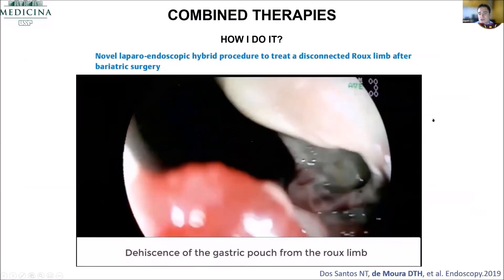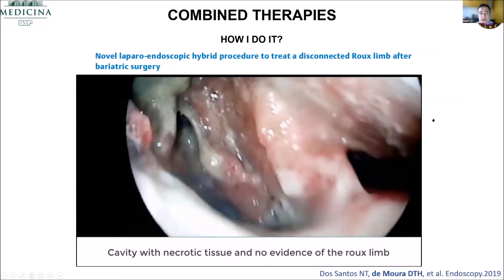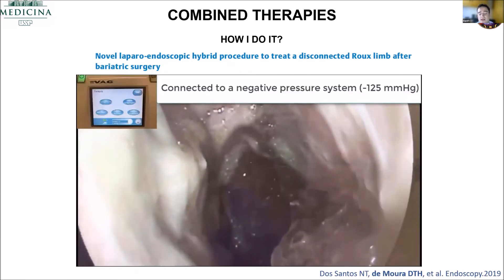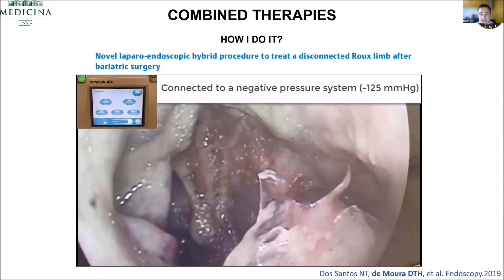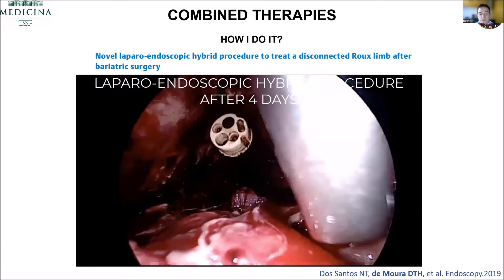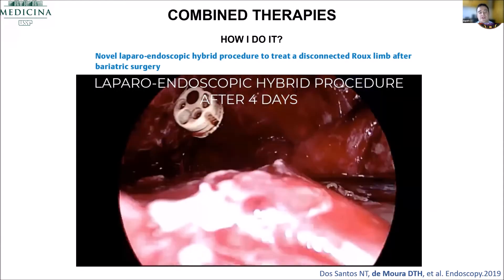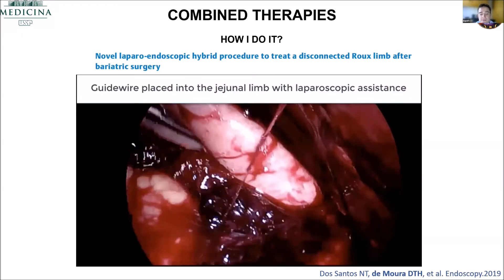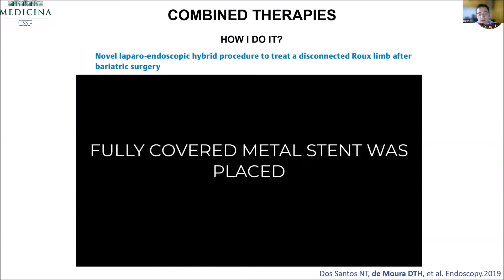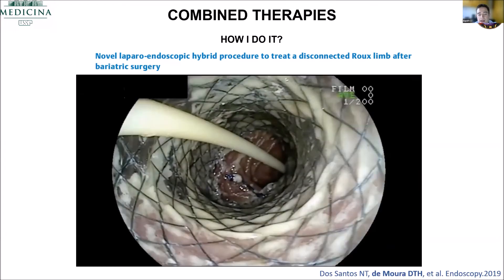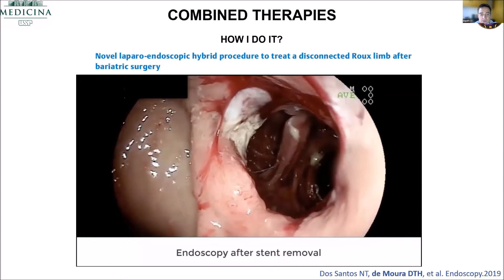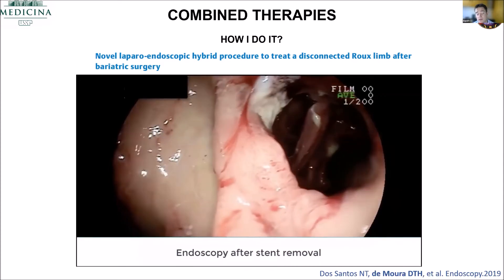This video shows that sometimes we need to work together with the surgeons. This patient was in very bad condition. We placed the modified endoscopic vacuum therapy, and after four days, we went with the surgeons. The surgeons found the limb and we placed a fully covered metal stent. After four weeks, the anastomosis was again very well. So a combined surgical-endoscopic approach is also an option.